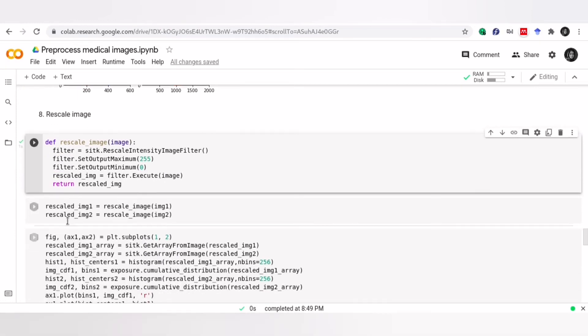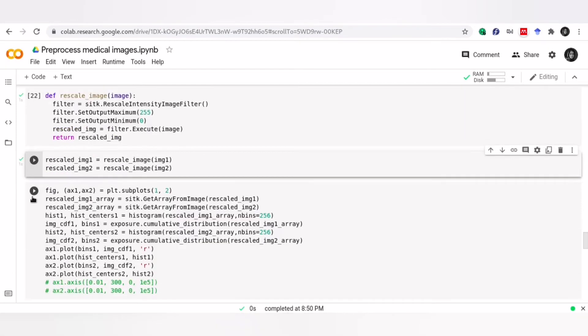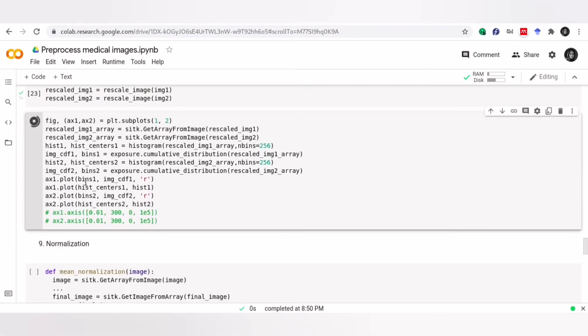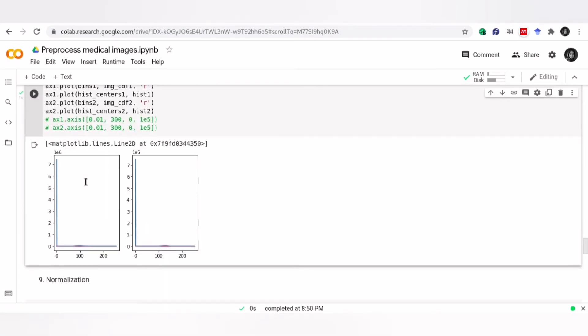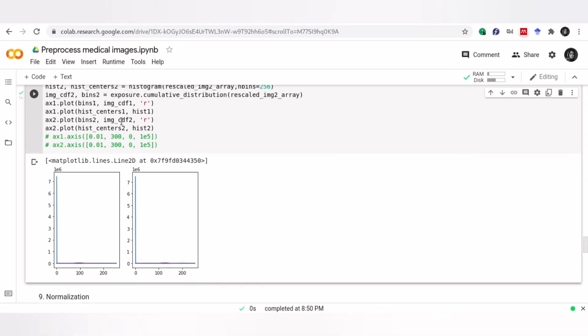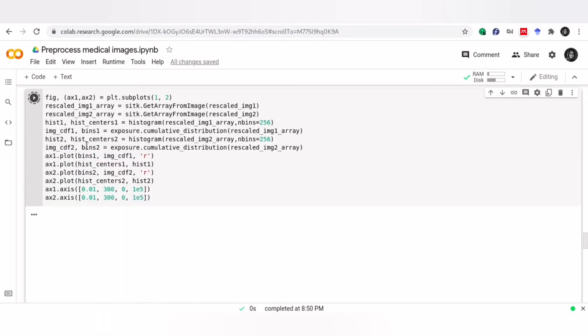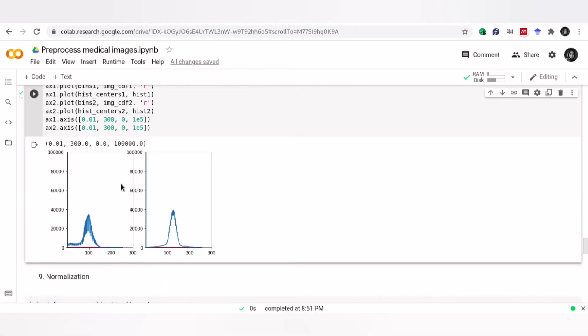Now, let's plot our histograms again and see the difference. Let's zoom again. As you can see, now both of them have the same scaling.